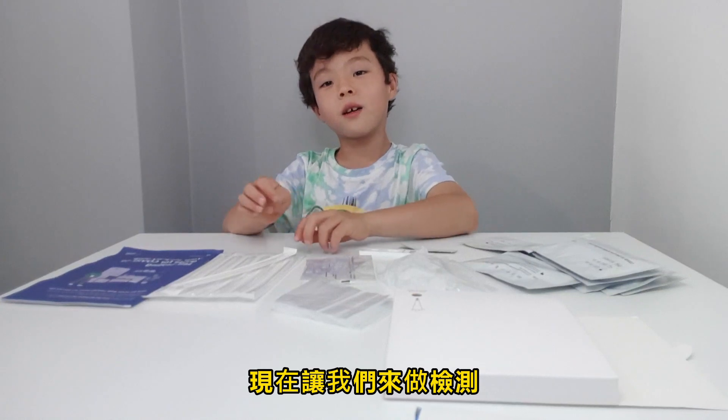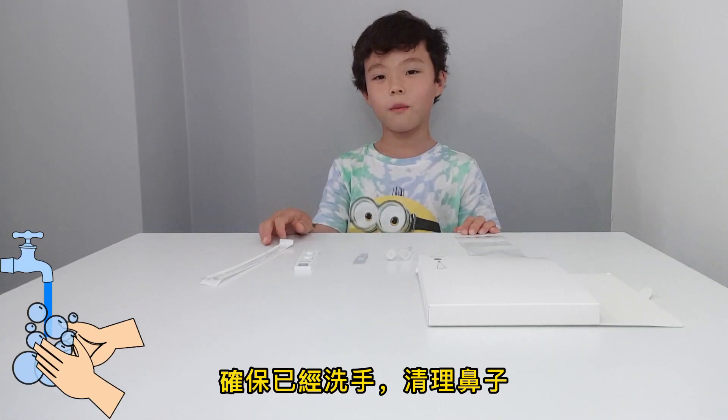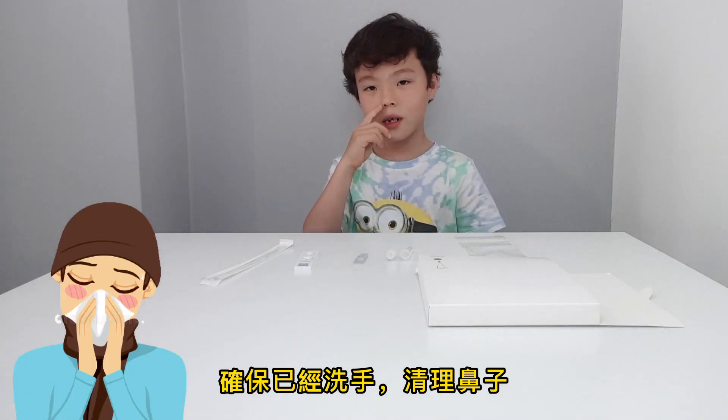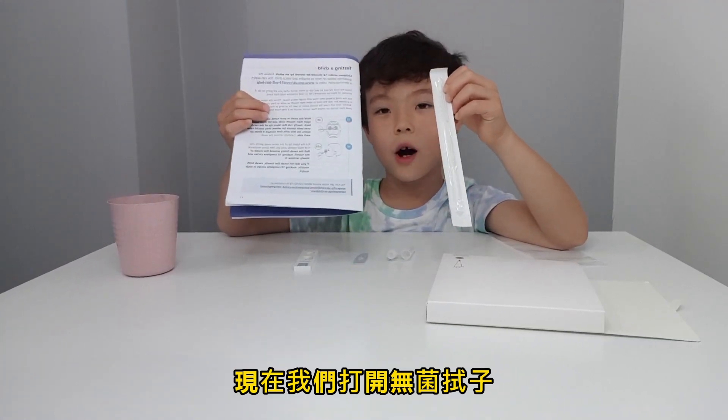Now let's do the test. Before you do this test, you have to make sure you have clean hands and a clean nose. Also clean the surface. Now we will open the swab.